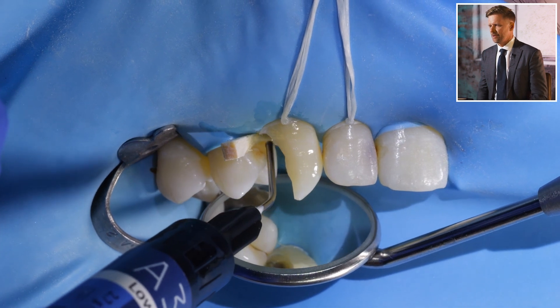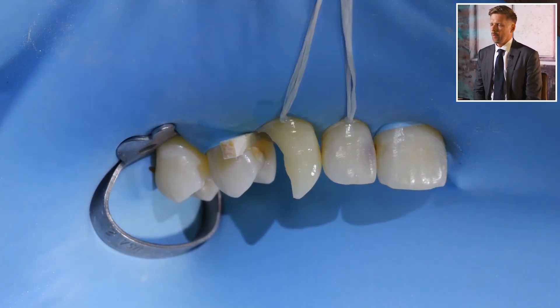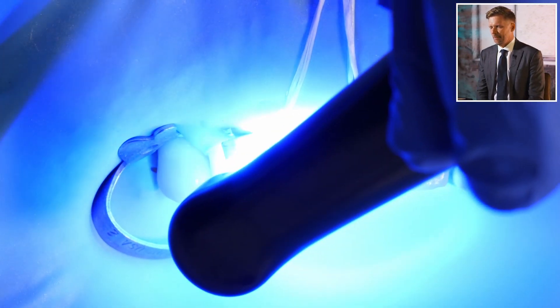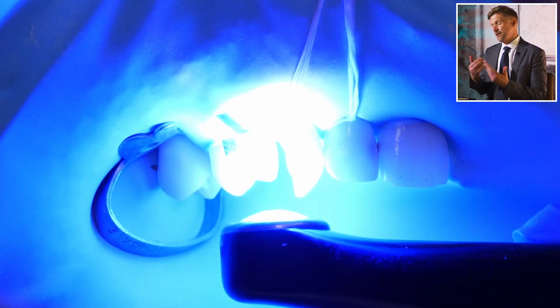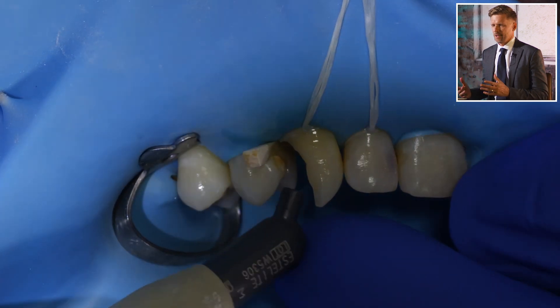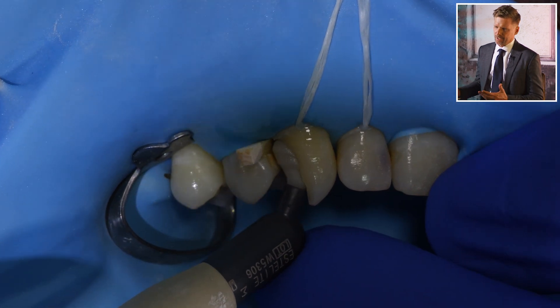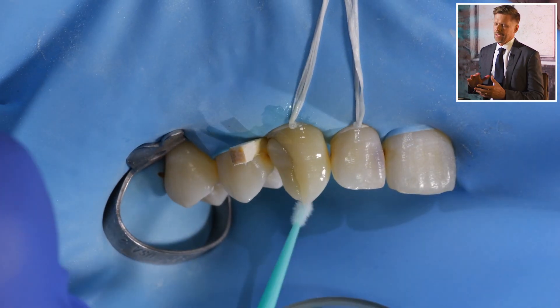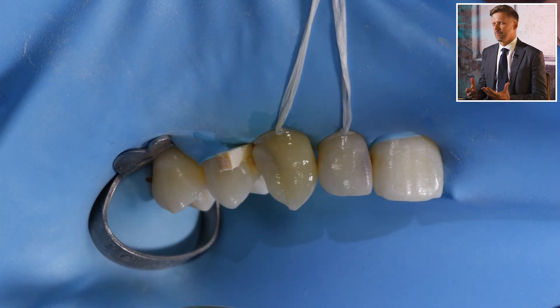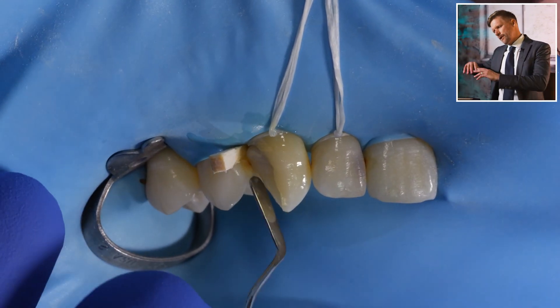We'll cure that, and now what you'll see is I'm building up a little hip — a little area where we can place a wedge and put a matrix against it. Right now the restoration is quite subgingival; even though the rubber dam hides it, we've got a very subgingival restoration. If I don't build that little hip, there'll be nothing to hold the matrix in place or wedge it against.